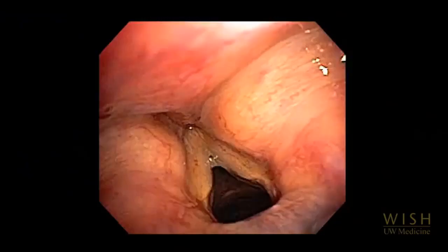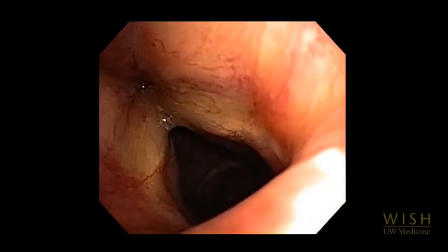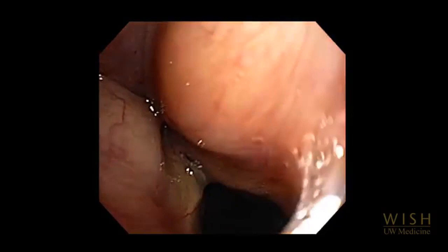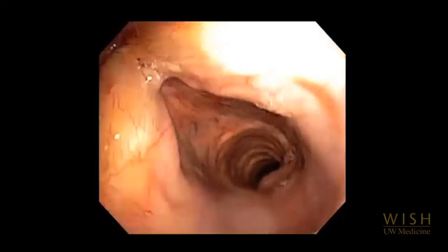Initial entry of the trachea often causes significant cough, so most bronchoscopists administer a dose of lidocaine into the trachea once they pass through the vocal cords. If cough is severe, the patient may need more topical anaesthesia or more fentanyl or both. Try to keep the tip of the bronchoscope and therefore the image in the centre of the airway at all times to avoid causing trauma.